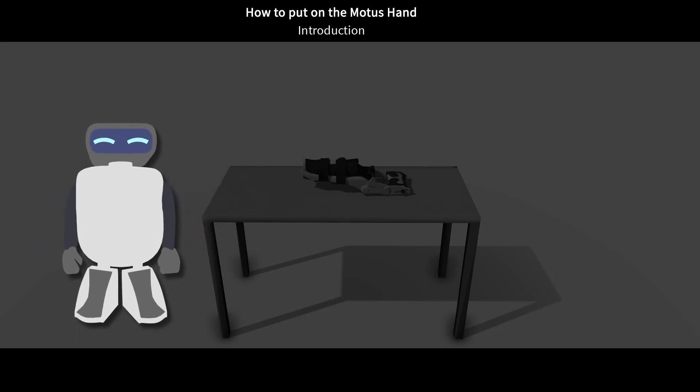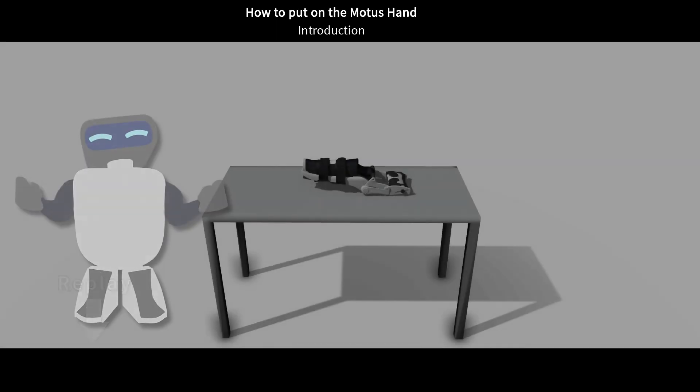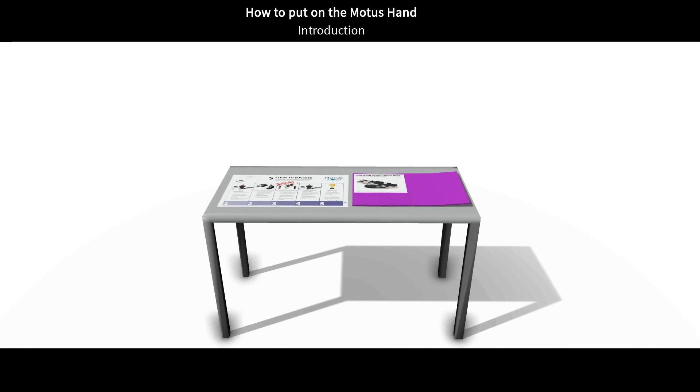If you need to see a step again, be sure to press this button here to replay that section. If you would prefer to follow along with a paper document, you can find a guide in the purple folder included in your box.